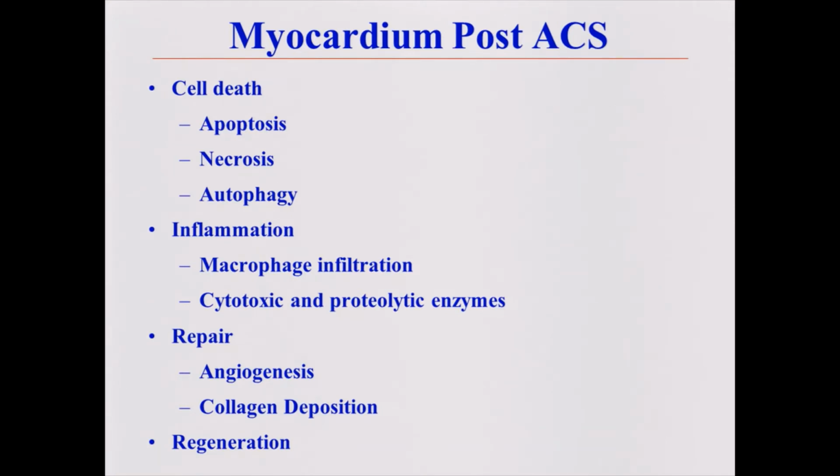Let's move on to the myocardium now. And there we have a lot of tools that are working well. Matthias showed some of them. I'll show a few more, and I'm sure Pete will show even more than those. So the myocardium is a very nice imaging target.